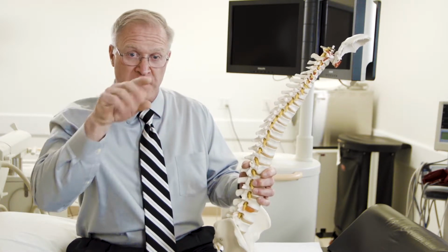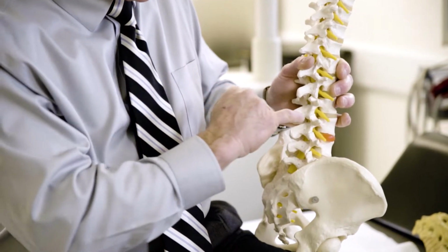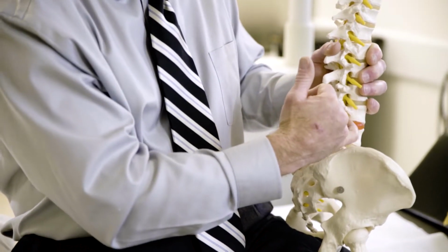On that day, an IV will be placed so we can have some light sedation, because the goal is to take a very small needle that is so small that it has a little bend on the end that allows us to steer the needle around corners. Once we've numbed the skin, we're going to guide that needle very carefully around the corner into the small bony opening where the nerve root exits.